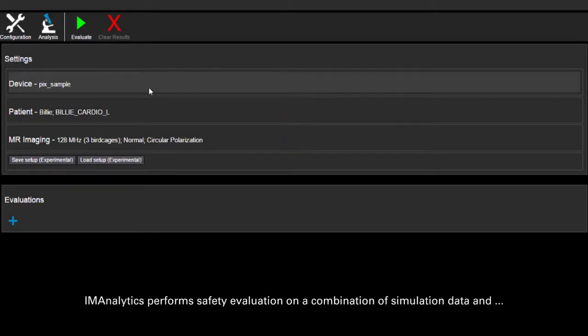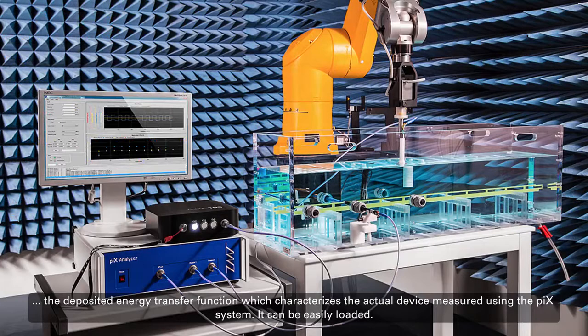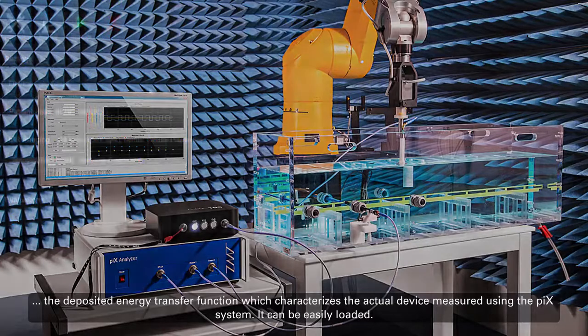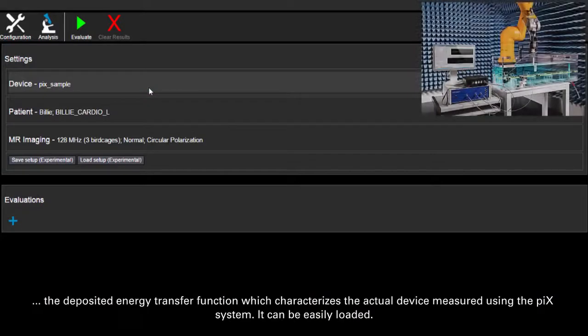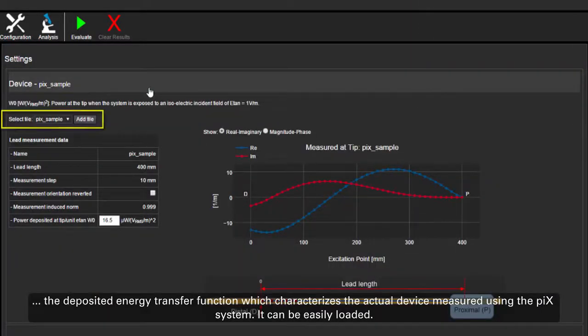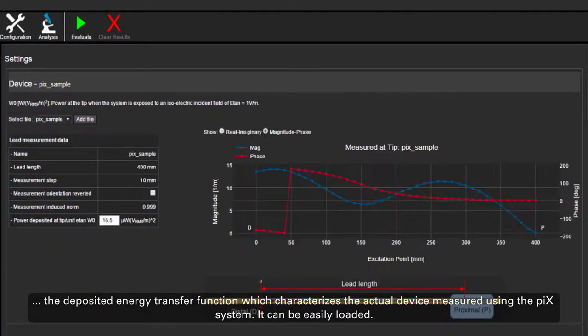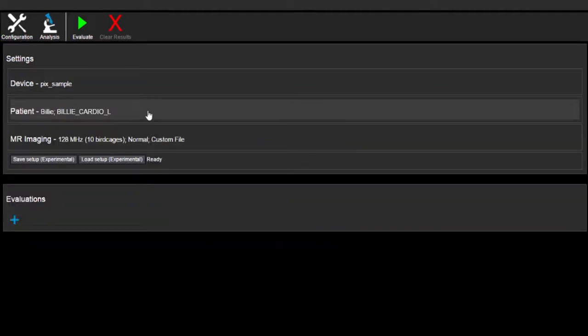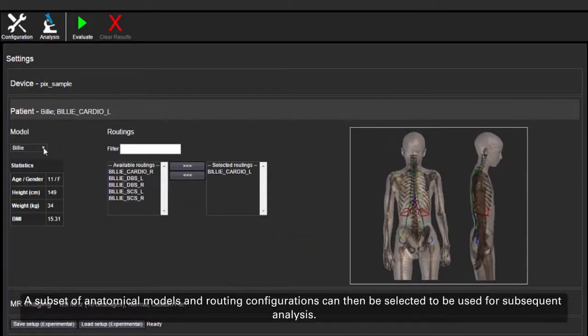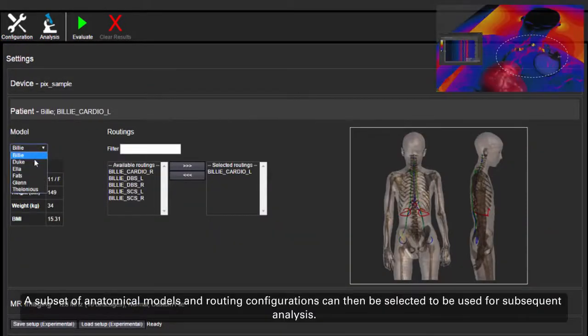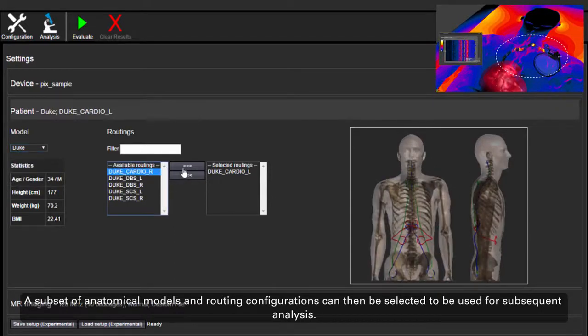IM Analytics performs safety evaluation on a combination of simulation data and the deposited energy transfer function which characterizes the actual device measured using the PIX system. It can be easily loaded. A subset of anatomical models and routing configurations can then be selected to be used for subsequent analysis.